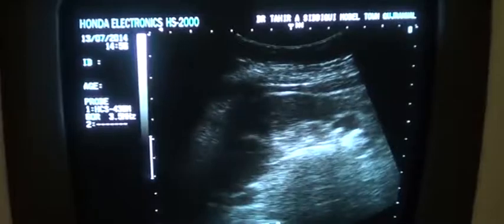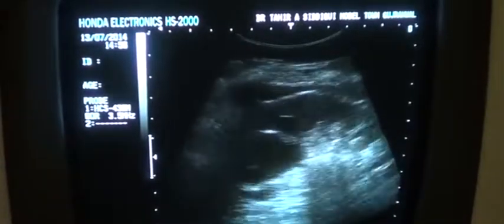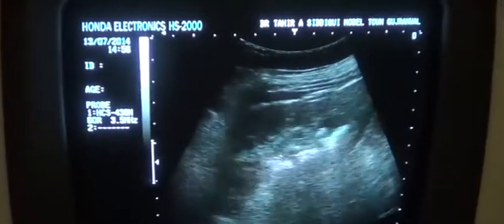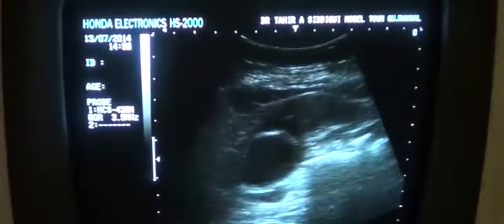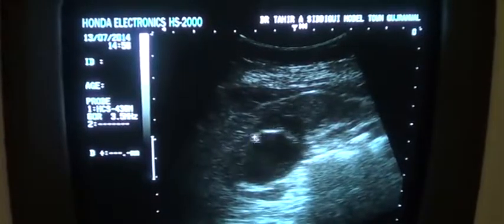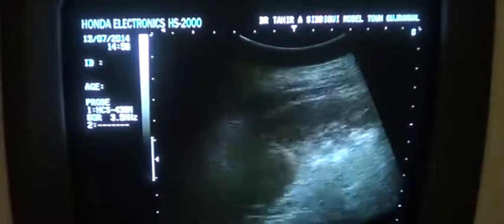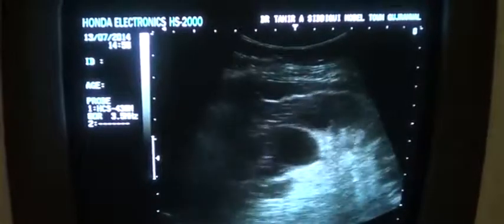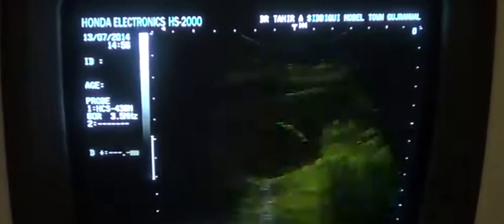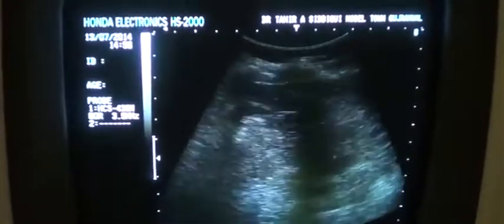For this we should have a plain X-ray abdomen performed to see whether it is really Staghorn calculus or scattered calculi with a large one in the renal pelvis. Now this is not a cyst. This is a dilated calyx. Why is this not a cyst? We do not see posterior wall acoustic enhancement, and it changes its shape when I move the probe.